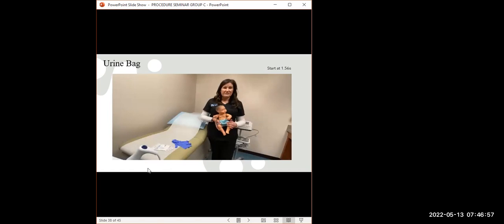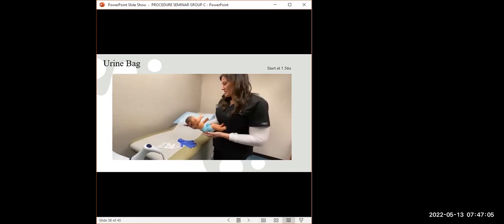Hey everyone, it is Professor Lee. So I'm going to show you how to put a urine collection bag on an infant or a baby who is still in diapers.